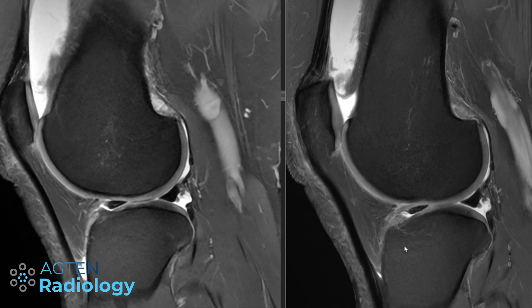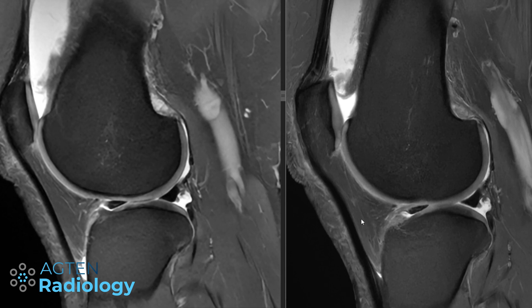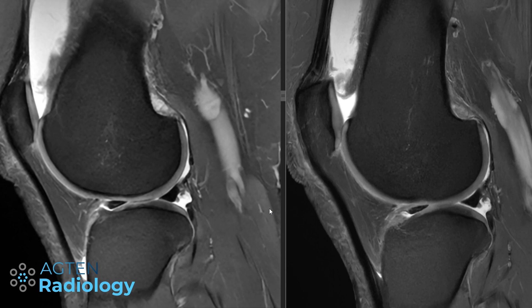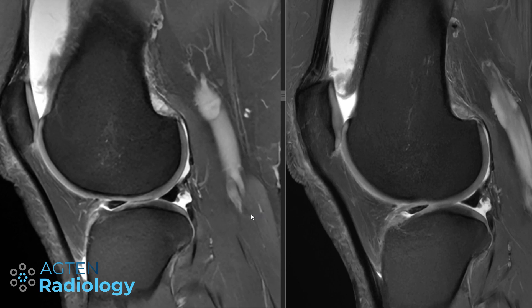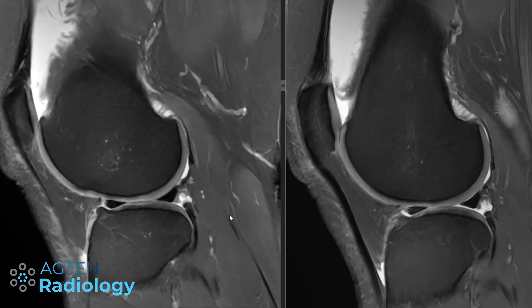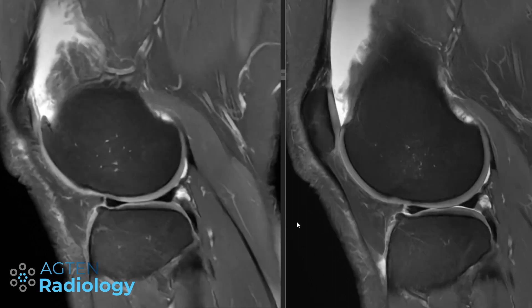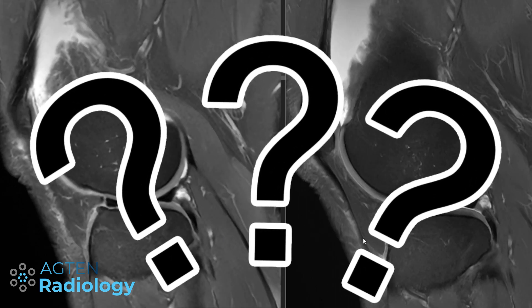This is a 3-Tesla MRI scanner from GE — the Pioneer with AIR Recon DL, the artificial intelligence algorithm that makes things look nice and fast. Which one do you think is the sequence that takes less time?